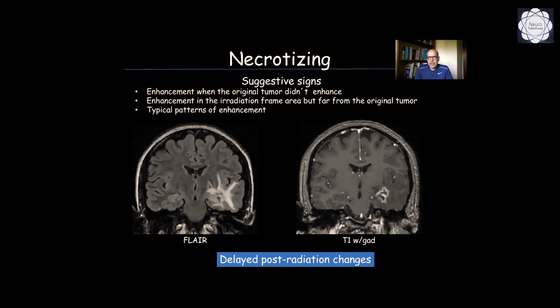Regarding necrotizing lesions, there are some, especially radiotherapy, that may be associated with necrosis. There are suggestive signs such as enhancement when the original tumor didn't enhance, enhancement in the irradiation frame area but far from the original tumor, and typical patterns that we have to recognize.